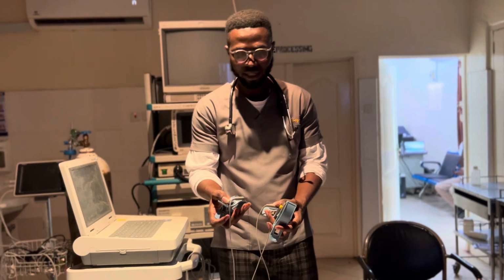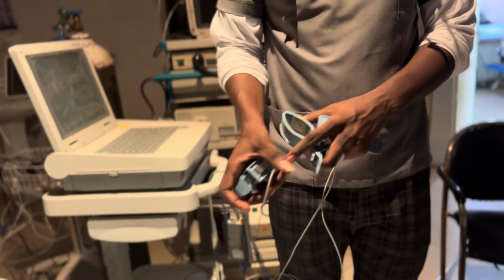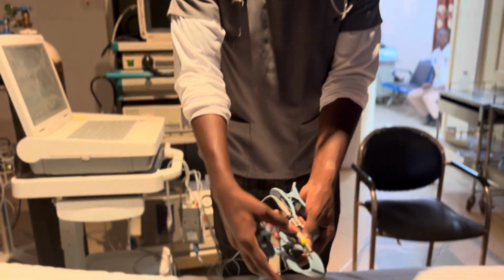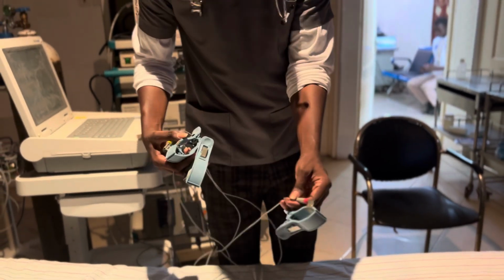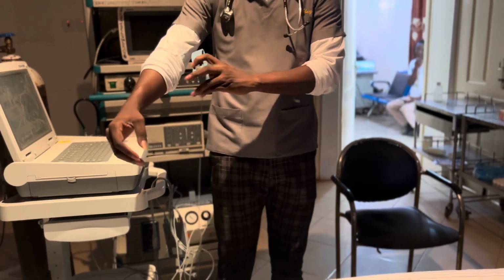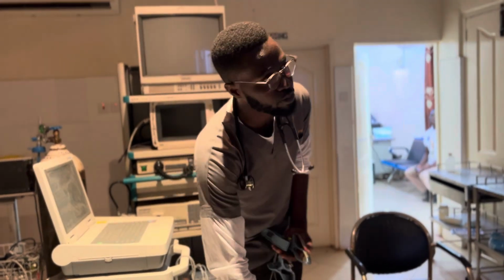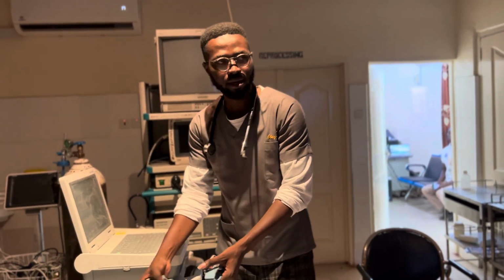Do you understand? So I was telling you not to keep the colors in your head. And as you can see, Zadat, can you come? You see that this is green, and they've labeled it foot. So there's no need to keep green in mind, but we may go to an ECG machine where it has not been labeled, though ideally it is labeled. Look at yellow: left. Then neutral, black, here. And look at red. Red is what? Right arm. So you are going to put it here, like that. We'll demonstrate that. So these are the limb electrodes that Einthoven spoke about when I was teaching the ECG. You put one here, one there, and then one there.